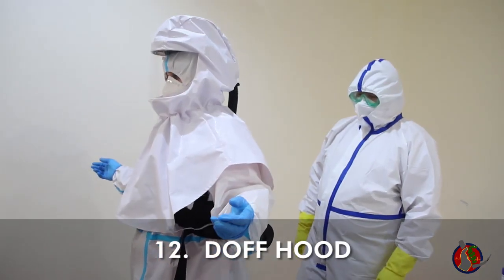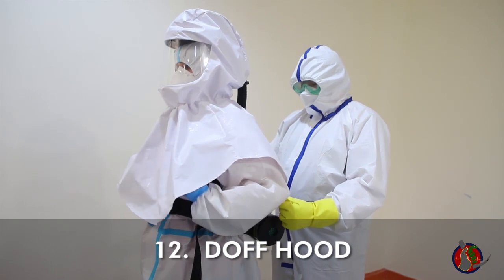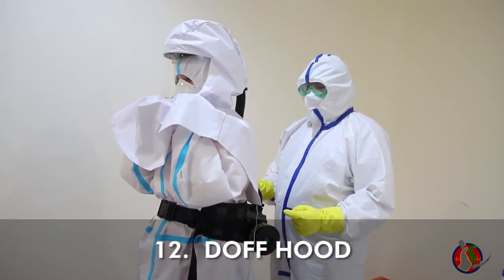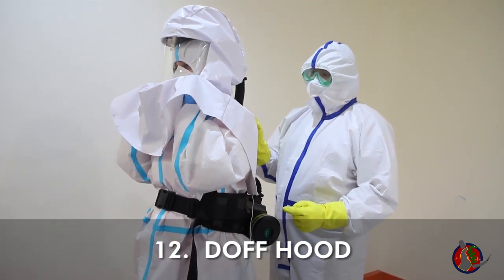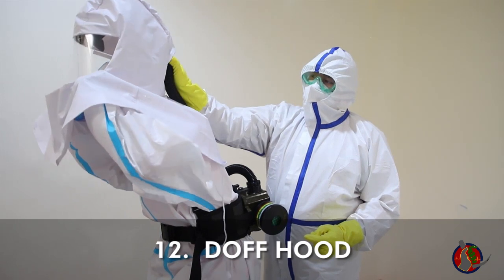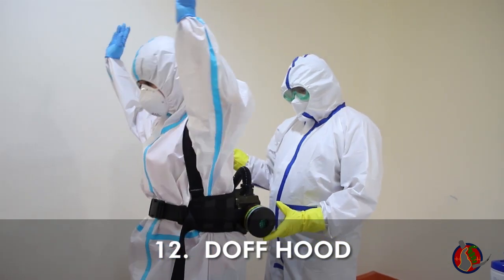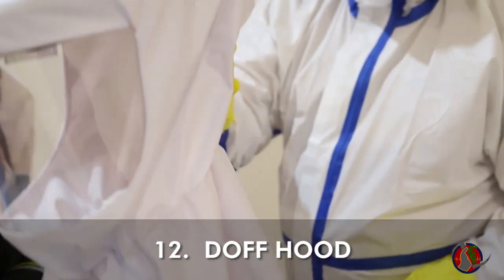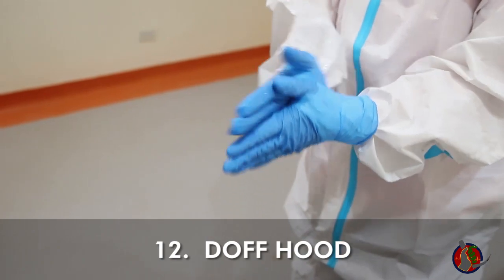Doffing the PAPR hood is a two-person task. With your buddy standing behind you, have buddy release the Velcro arm straps. Slip both hands under the hood and grasp the bottom face frame through the underside of the front part of the hood. Make sure your fingers do not cross above the guarded neck area into the face area. Lean forward slightly, then lift the hood upward and backward toward your buddy. Disconnect the breathing tube from the hood and place the hood in a disinfection bin. Do hand hygiene.